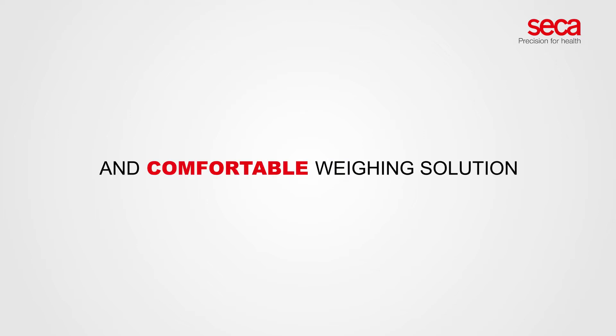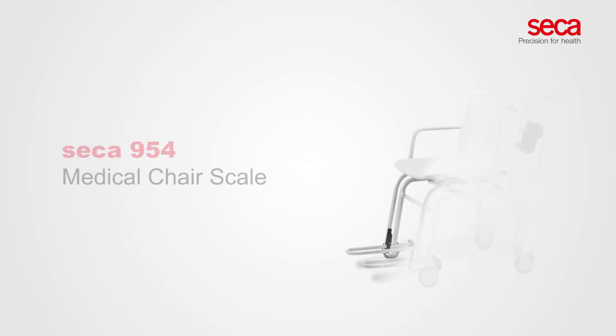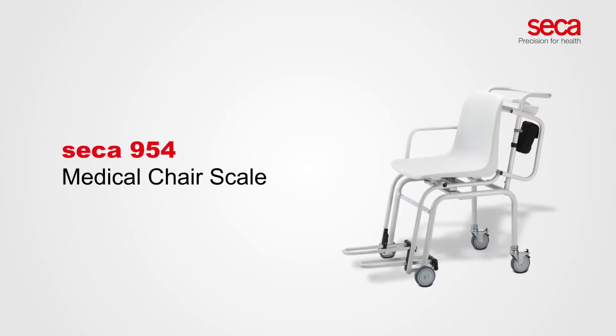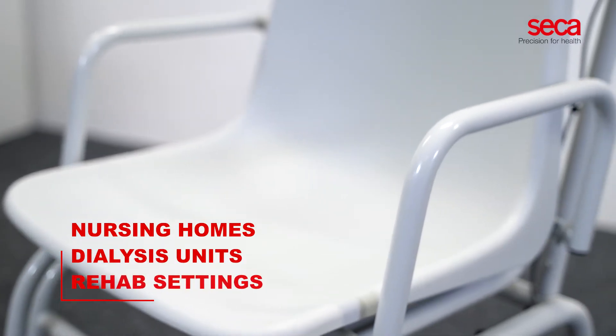A safe and comfortable weighing solution for patients with mobility issues. The Sika 954 Medical Chair Scale is the perfect solution for nursing homes, dialysis units, or rehab settings.